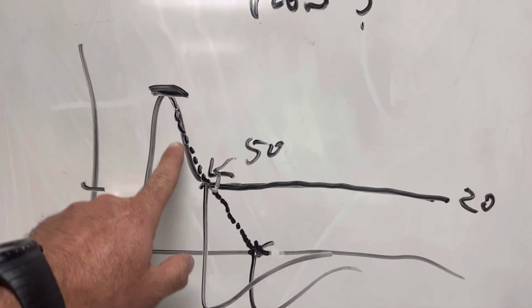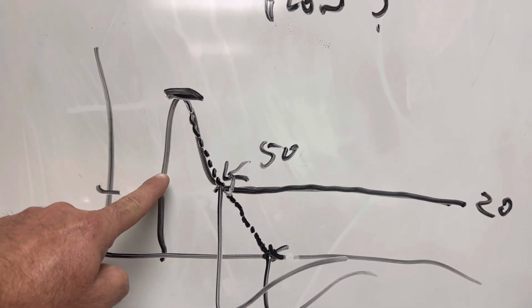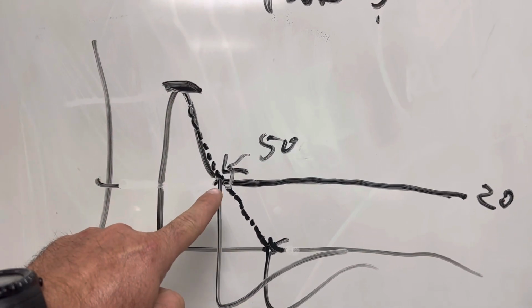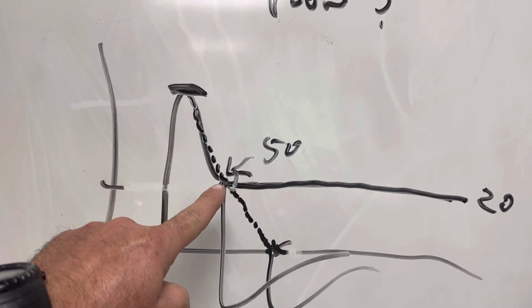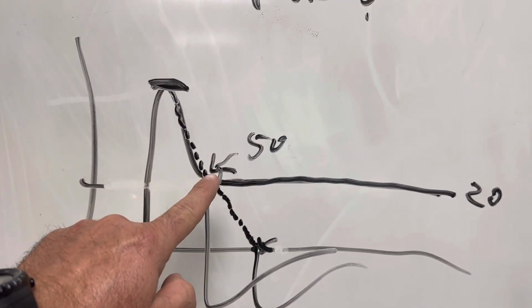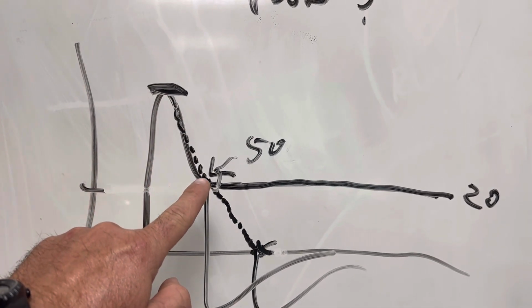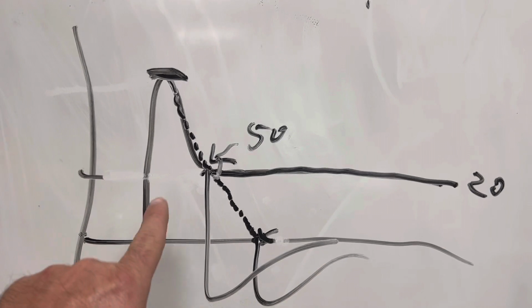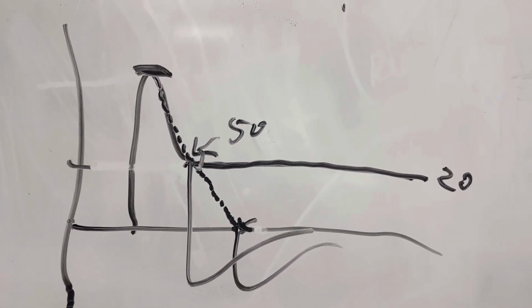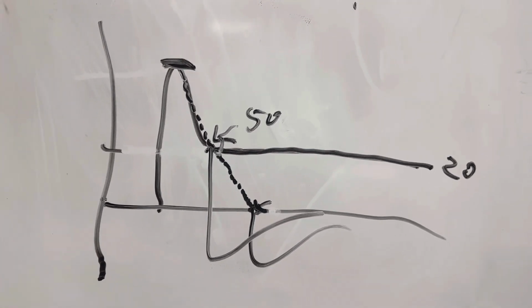At this point, which looks like 50%, if you look, this is the peak flow, it falls about here, and at 50% of the peak flow is where this leak problem happens. You would set your inspiratory cycle to 50% or maybe 51. Then the vent will wait for the flow to decelerate to 50% of its peak and then exhale. It will now force this I time into exhaling before that leak process happens. And that is how we would set our percent cycle.